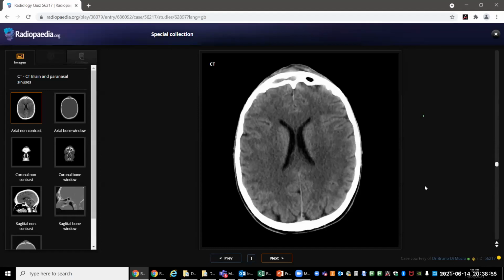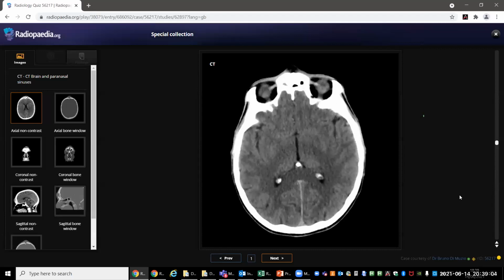Okay. So what are the possible complications you're expecting in this case in the brain? Okay, in the brain, I'm expecting the complication of epidural empyema.